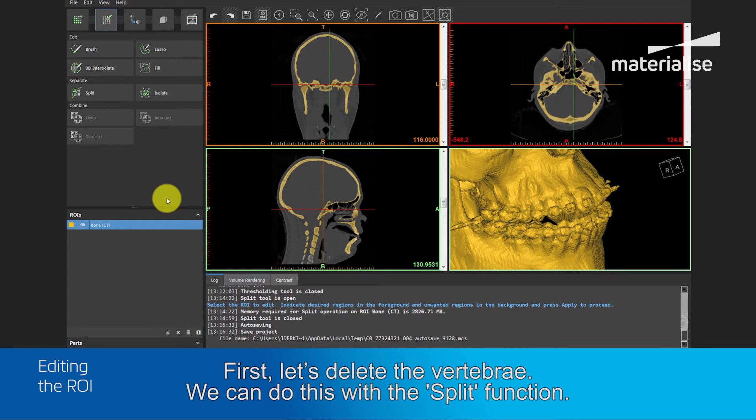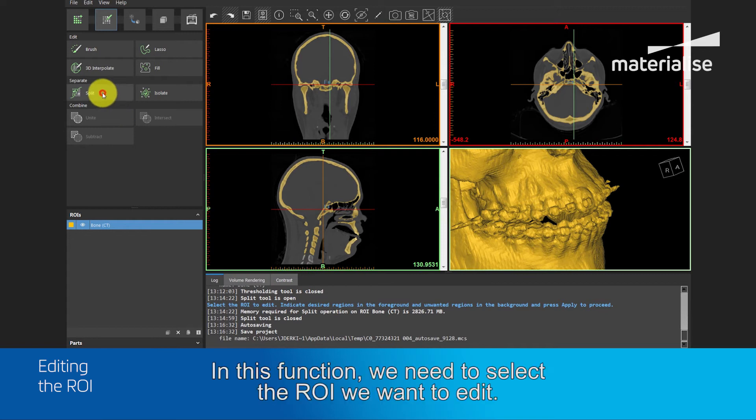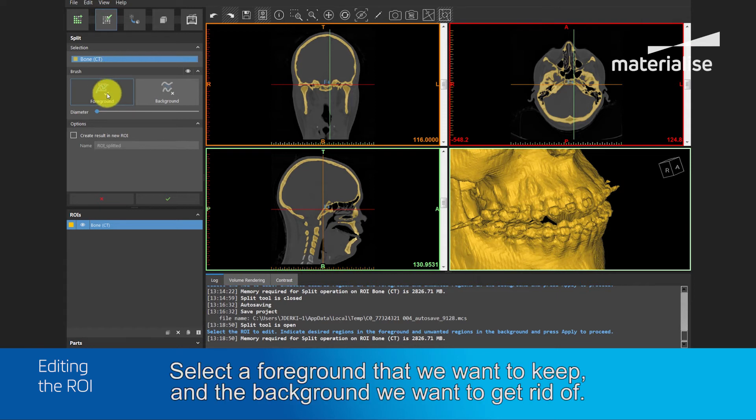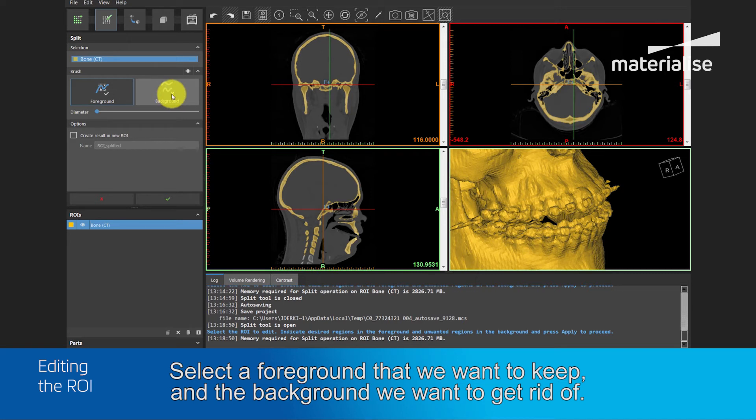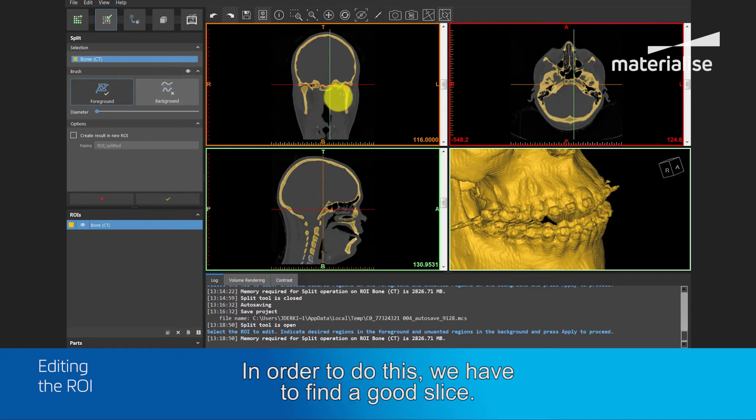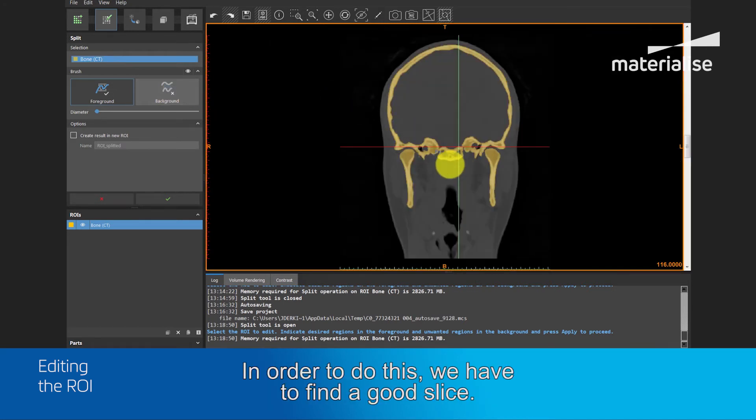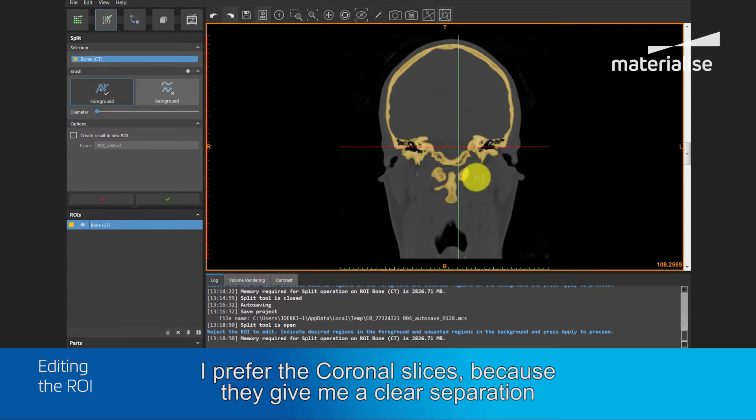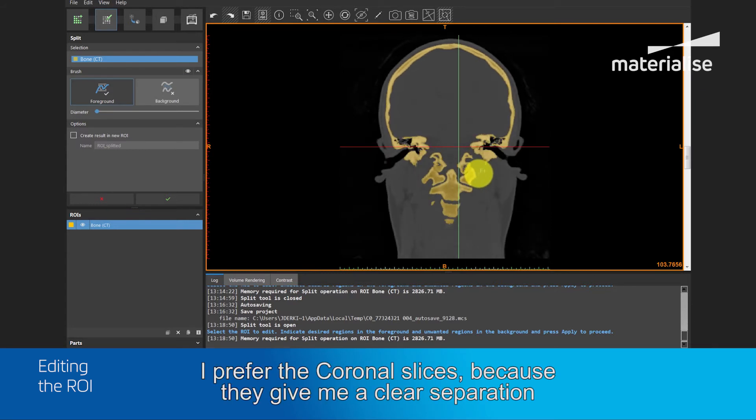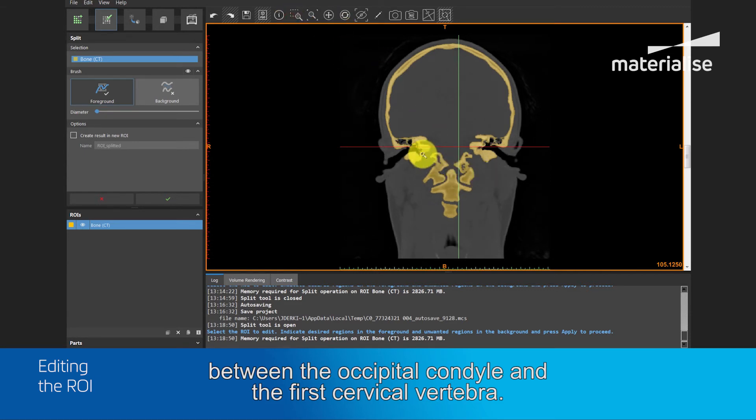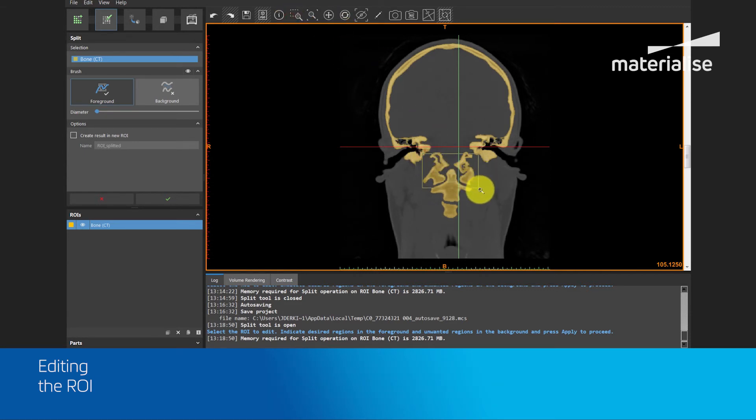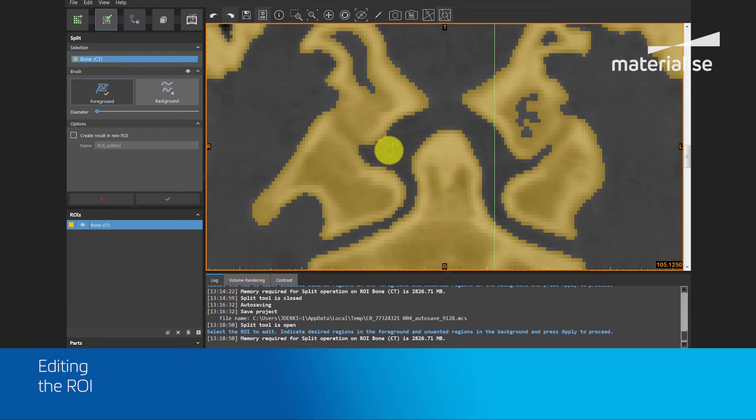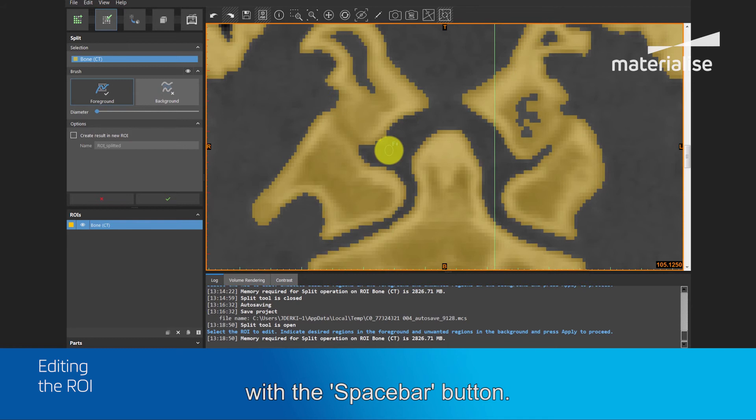We can do this with the split function. In this function, we need to select the region of interest we want to edit, select a foreground that we want to keep, and the background where we want to get rid of. In order to do this, we have to find a good slice. I prefer the coronal slice, because this will give a clear separation between the occipital condyle and the first cervical vertebra. And because I'm only going to use this view, I will enlarge the view with the space button.